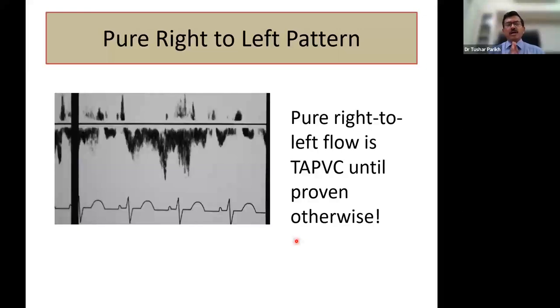So now this tells us about the right ventricular peak systolic pressure, or the pulmonary hypertension part. But again, we have to remember that along with pulmonary hypertension, most of the time there is right ventricular dysfunction. Dr. Mohit, I would like to know from you whether I should speak about right ventricular dysfunction, TAPSE and fractional area change.